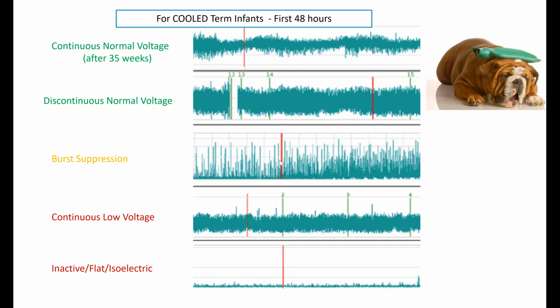So someone was asking about the lowest gestational age you've cooled: 34 in the cooling in our study. Otherwise we stick to 36. I'm not sure if that answers that question fully. And those 34 weekers are hard to control. They're hard to cool, yeah.